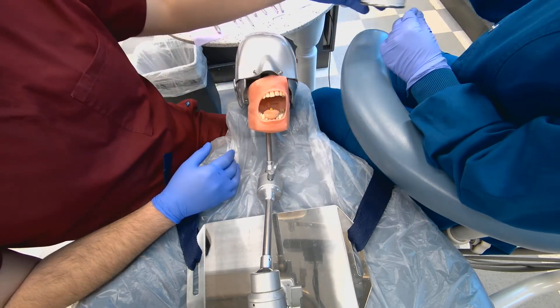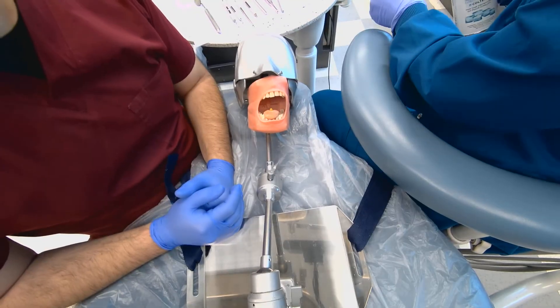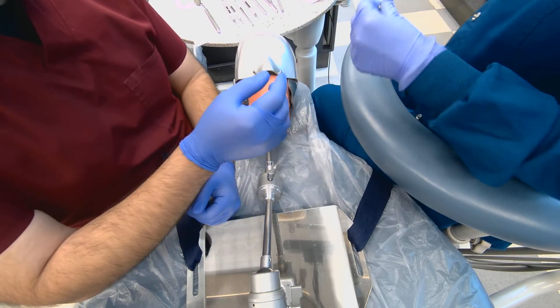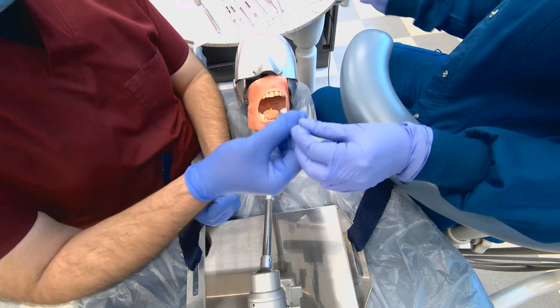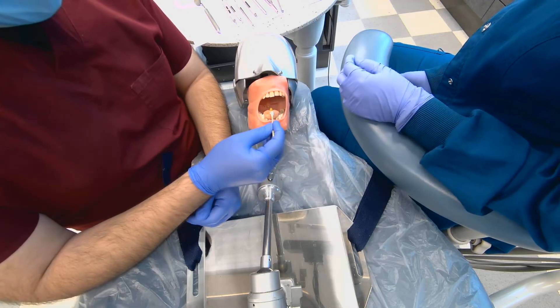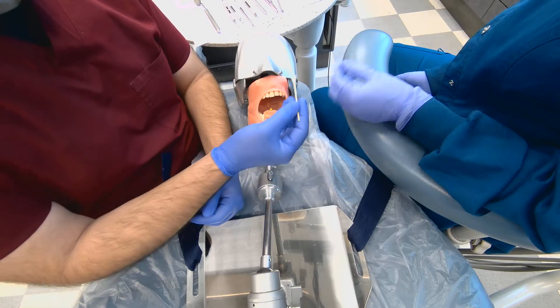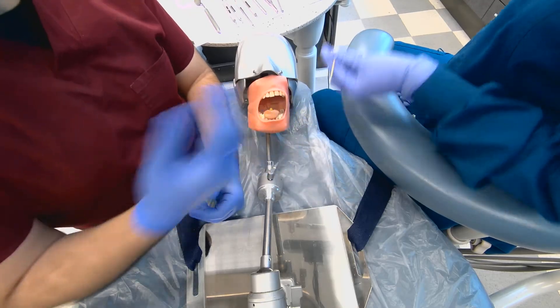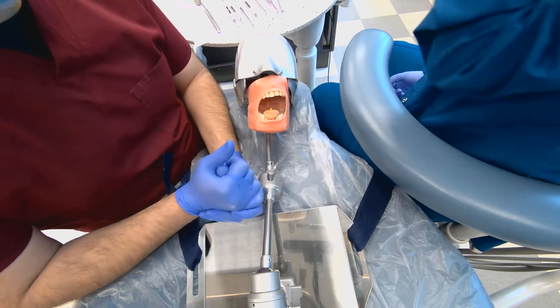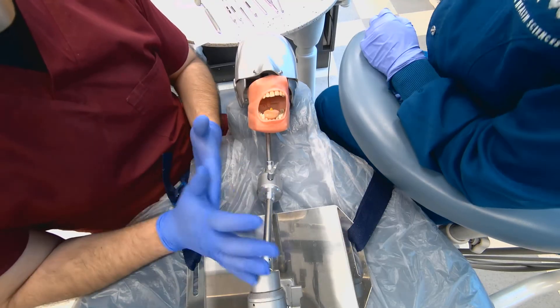We spread the endo-ice on a Q-tip and it makes it really cold. Then we test the tooth to see if the patient feels it or not, and test another tooth for comparison. If the patient doesn't feel it, that means the tooth is dead, and then we start the endodontic procedure.